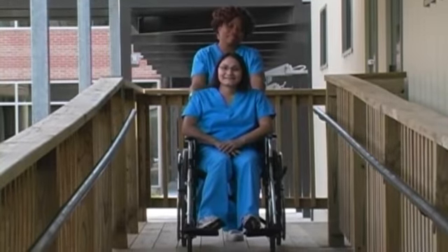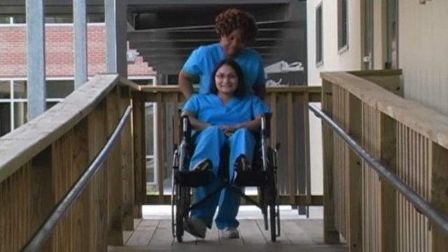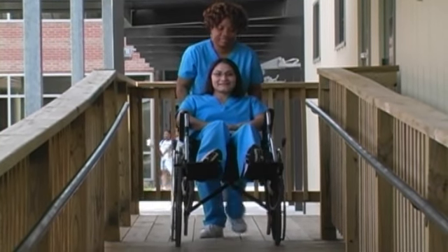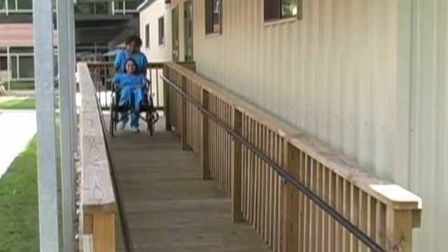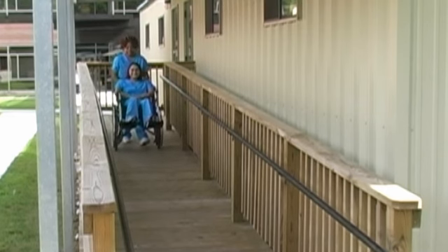There is an alternate method to assist a client down a ramp. Tilt the wheelchair backwards 30 degrees and ease wheelchair down the ramp in a forward position. The caregiver should keep knees slightly bent and back straight.